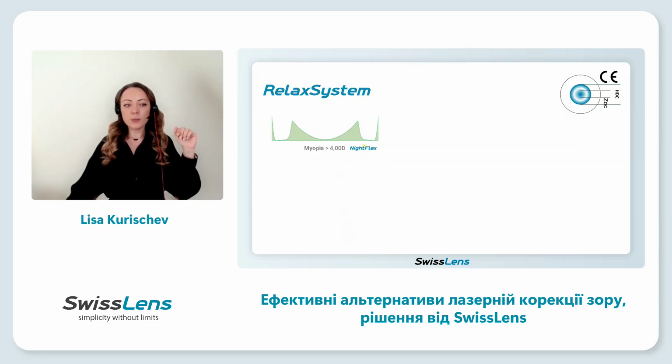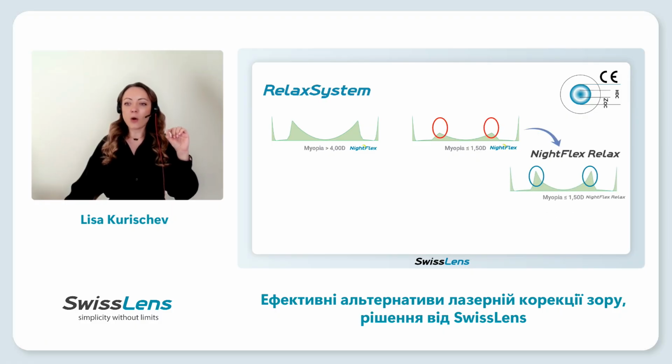But what happened with low myopia? Let's see it here. When we correct -1.5, of course, we have in the periphery plus 0.5, 1.5. So let's imagine a child with a correction like this. Since the correction decreases during the day, the effective defocus for myopia control works only in the morning. So sure, with NightFlex Relax, we are able to induce the peripheral defocus independently of the correction and without overcorrection of the patient. This is important. We don't want overcorrection.